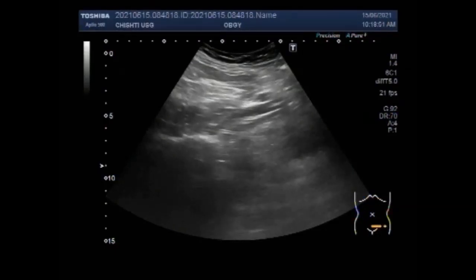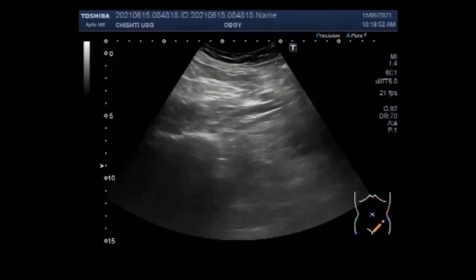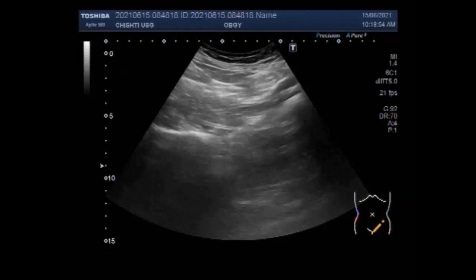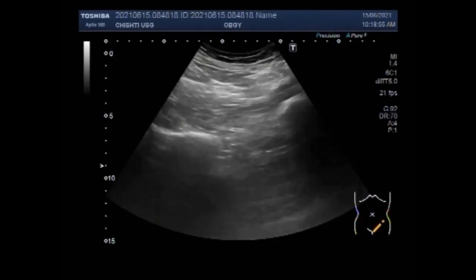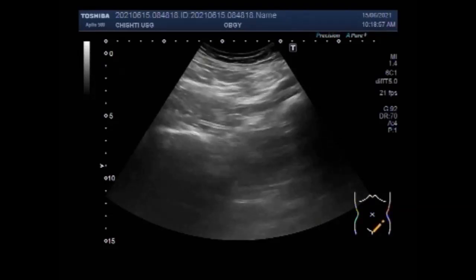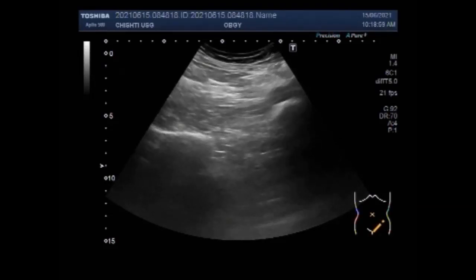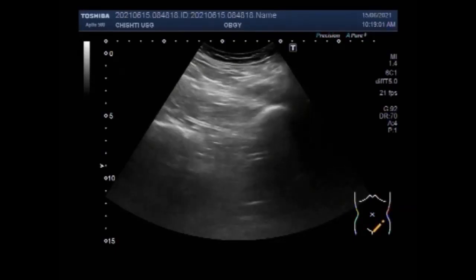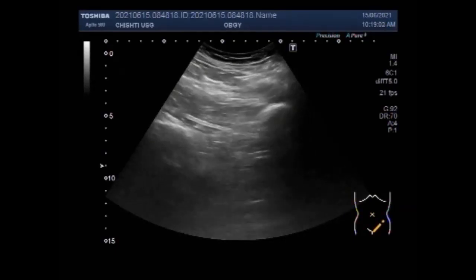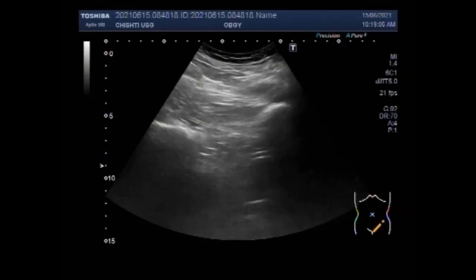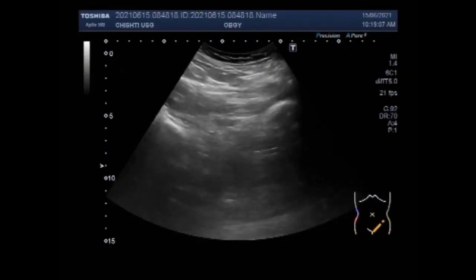Dear viewers, I hope you are all fine. This ultrasound video shows worm infestation in the gut loops. There are three videos — in the third video you will see the worm moving in the gut loop.